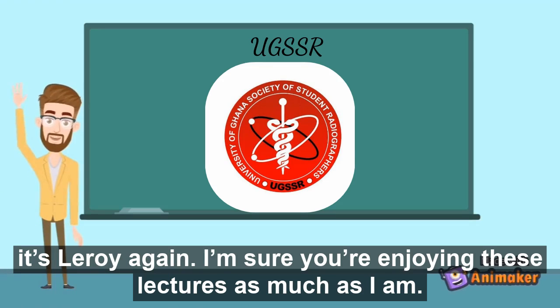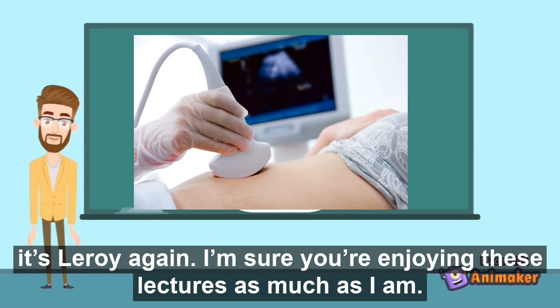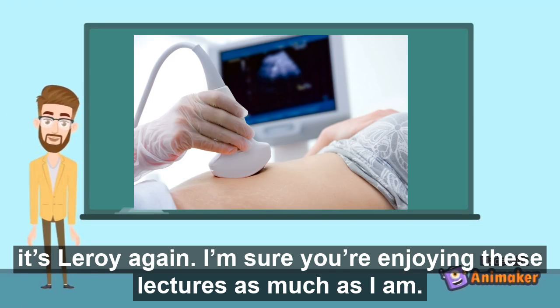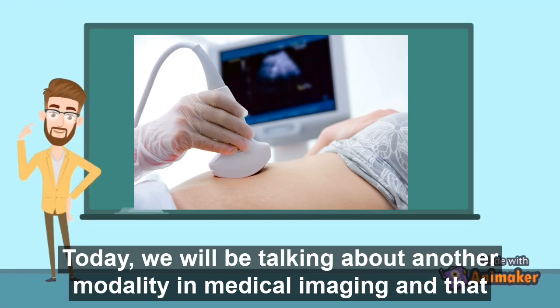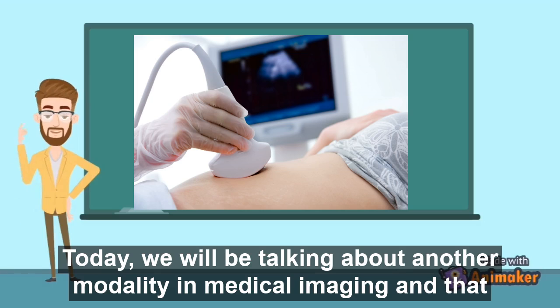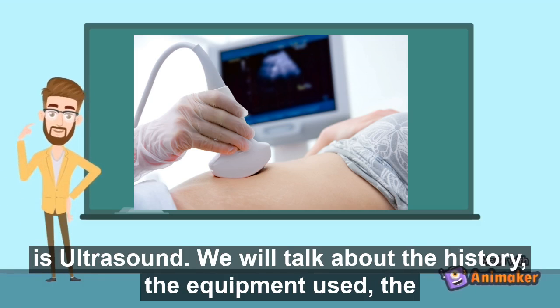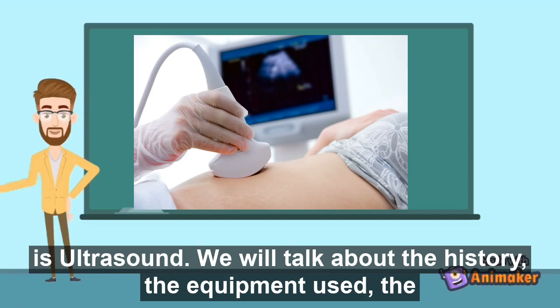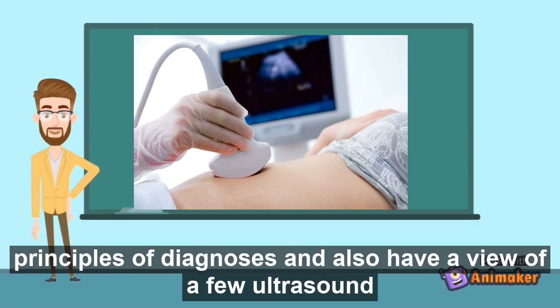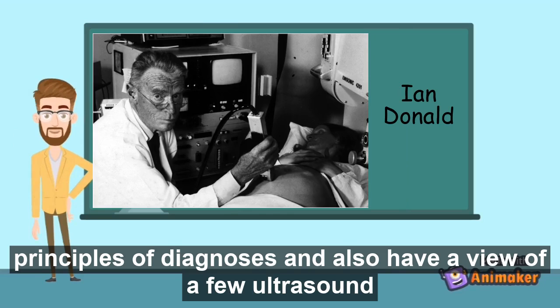Hello guys, it's Leroy again. I'm sure you're enjoying these lectures as much as I am. Today, we will be talking about another modality in medical imaging and that is ultrasound. We will talk about the history, the equipment used, the principles applied in diagnoses, and also have a view of a few ultrasound images.